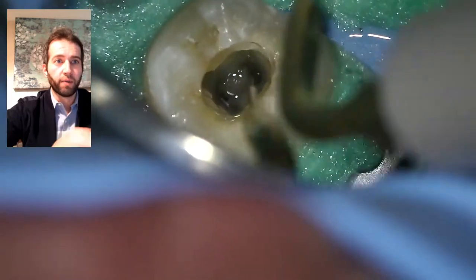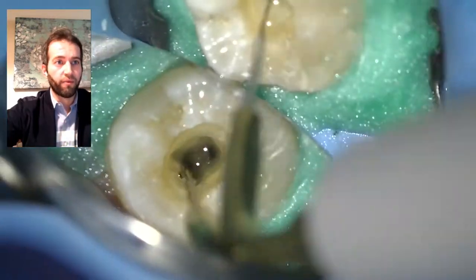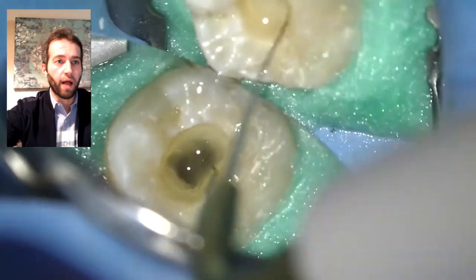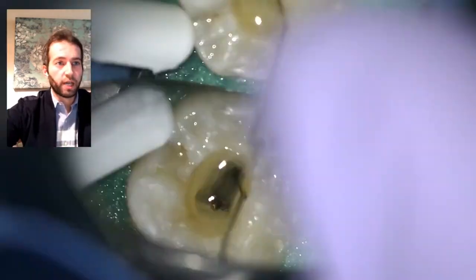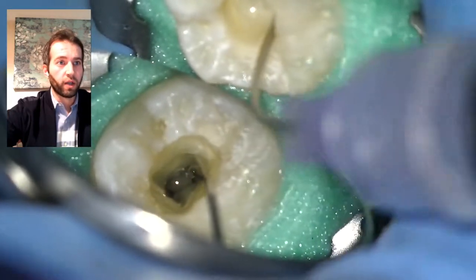I do it until the solution runs clear. It's still getting cloudy, so I keep going. Now we see things are starting to get less cloudy, meaning we're getting close to a final clean canal with no debris. I do it multiple times as long as it takes until it's nice and clean. Microsuction gives you an indication of how clean the canals are.